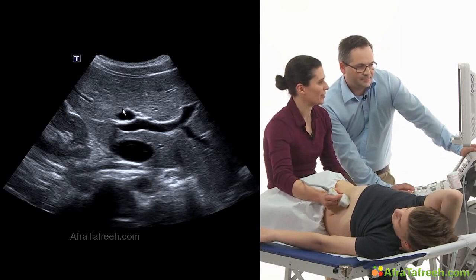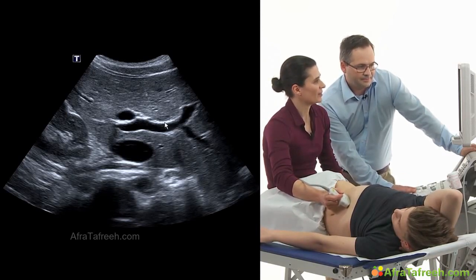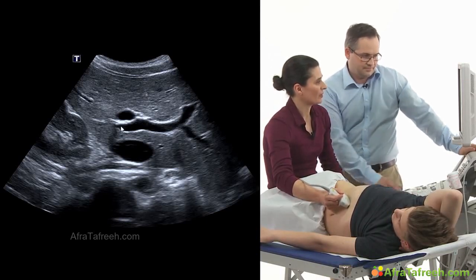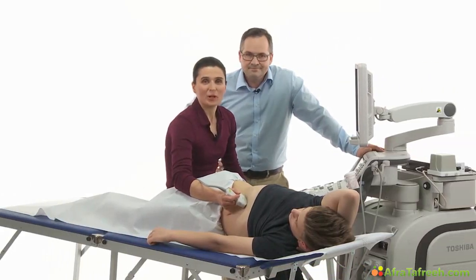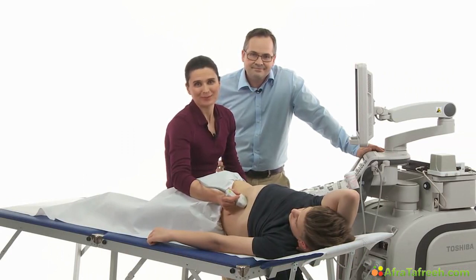And now it's really looking like a deer. It's got its front legs over there, show us please. And the head and his neck and the back and jumping over the vena cava. But this is not only our second animal in our scan, but also the second landmark you should document in every liver scan you perform.